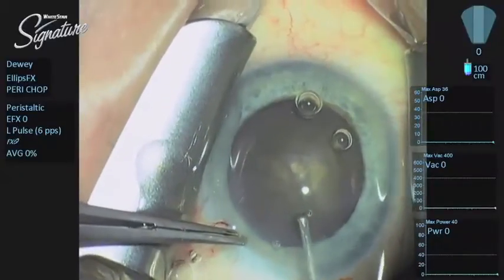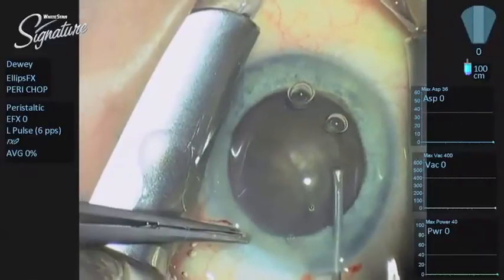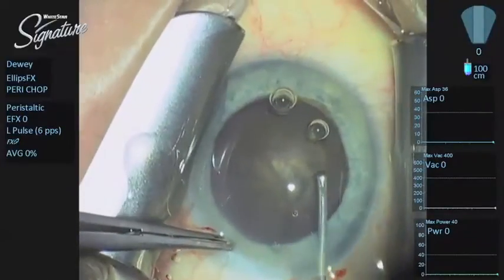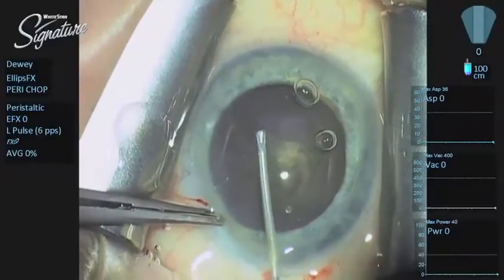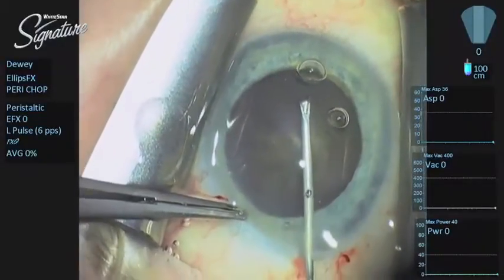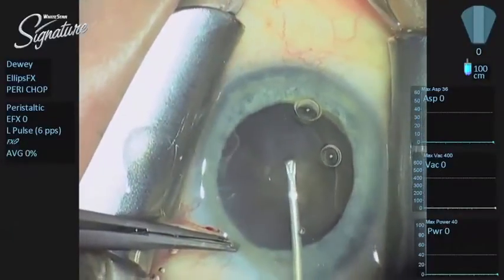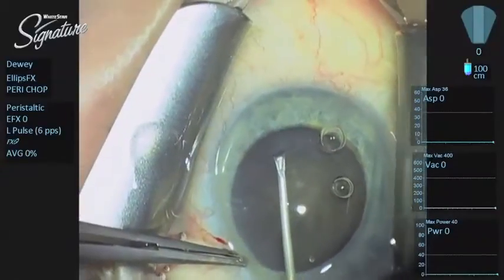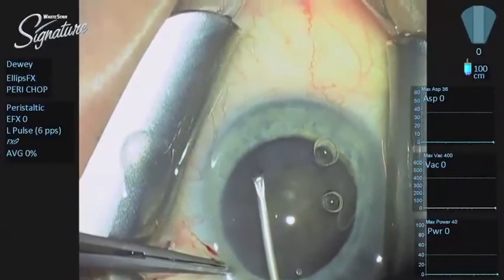The 2.2 or 2.4 millimeter system with Abbott Medical Optics Signature works tremendously well, primarily because of fusion fluidics. What this gives us is Ellipse FX, which is a fascinating modality for cataract removal. You have the combined transversal element, which is moving the tip side to side along with longitudinal movement all in one blended action.